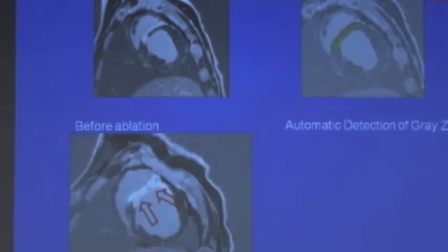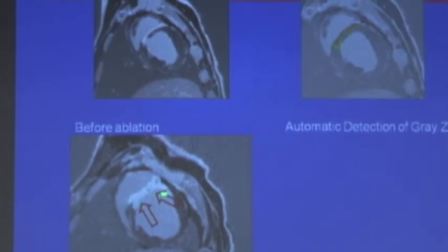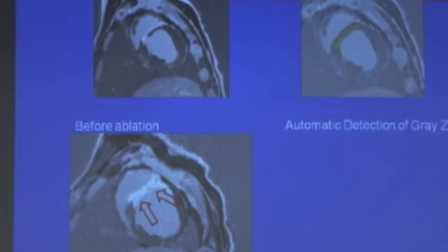And then, again, ablating without image guidance. This was no image guidance at all in terms of the gray zone. In fact, this whole area now is destroyed. It's just all scar. And this acutely, or actually this isn't scar yet, this is just the destroyed tissue. And in fact, these dark areas here are not tissue that was missed. They're actually steam pops. There's no tissue there, so you can't hyper-enhance when there's no tissue there.